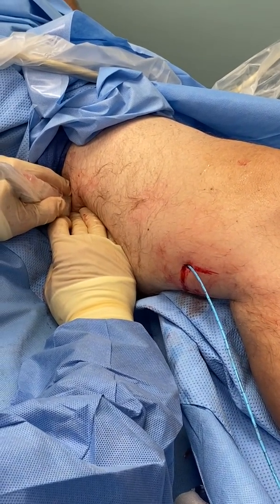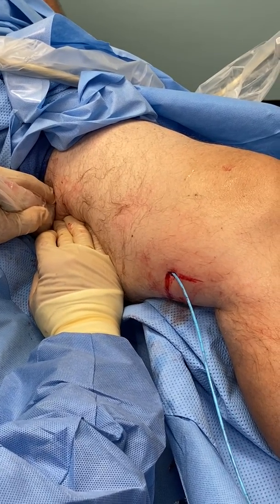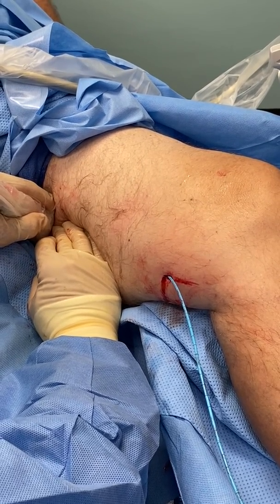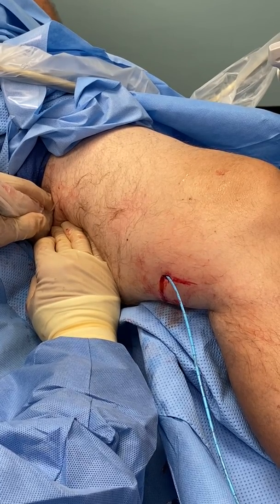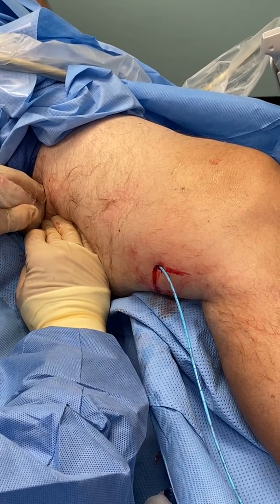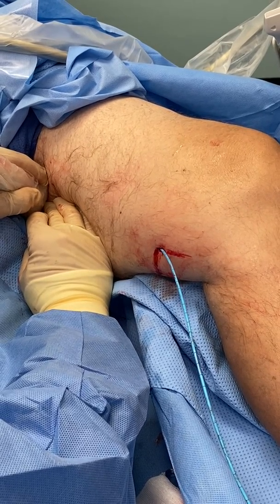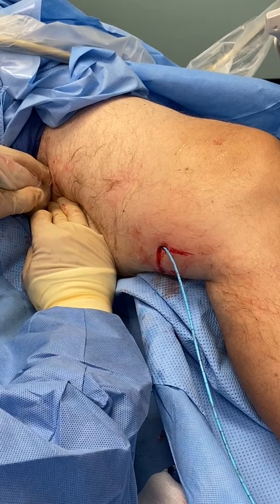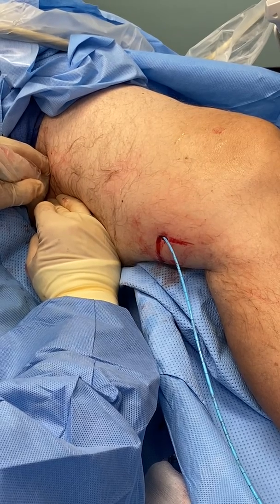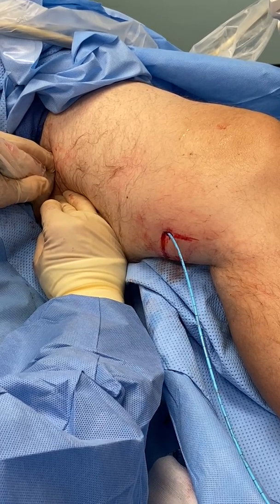His veins are going to be an excellent candidate for this type of procedure — they're not very big. He's got some reflux coming down into the lower segment of his leg. He has some other issues being taken care of: he has some knee treatments and some spinal treatments coming up shortly. So again, this procedure is about the same amount of time as other procedures.